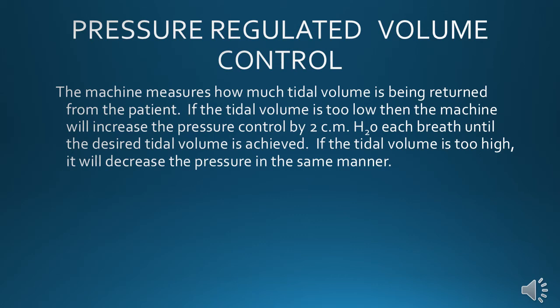The pressure will change very rapidly and have large fluctuations. It's these large fluctuations in pressure that also make large fluctuations in flow. All of these things actually create damage to the lungs. It creates microscopic tearing or shearing injury to the airways. These are the things that cause ARDS to happen.